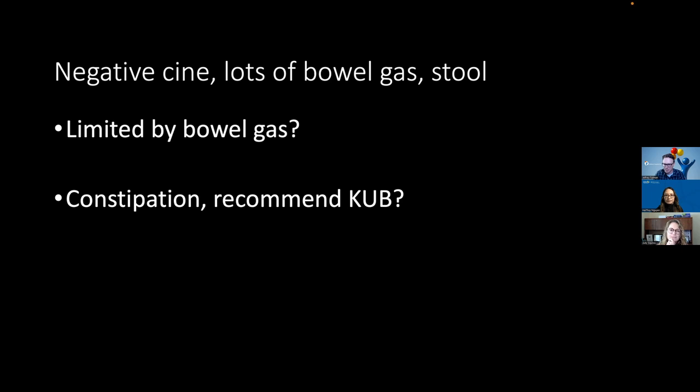I have to say, several times I have done an air reduction, and I see distal small bowel gas. So I'm like, oh, I think I'm done, but I see a little small gas. So I go to ultrasound after I do an air reduction. There's gas everywhere and you can still see. So I don't care: bowel gas, no bowel gas, ultrasound.